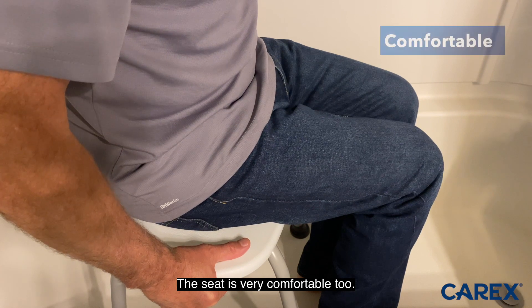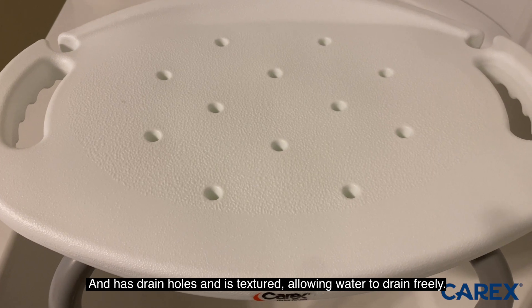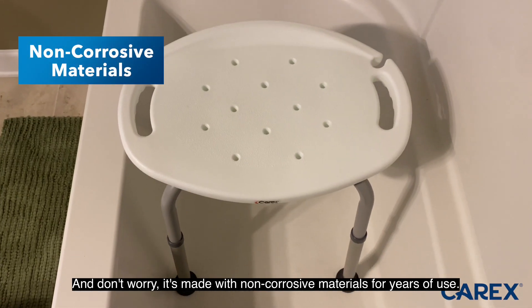The seat is very comfortable too and has drain holes and is textured, allowing water to drain freely. And don't worry, it's made with non-corrosive materials for years of use.